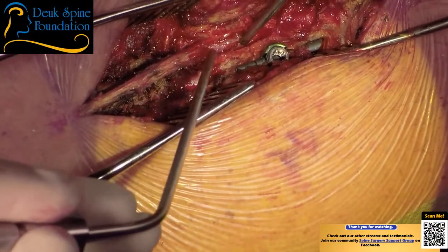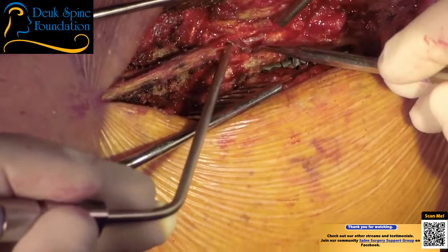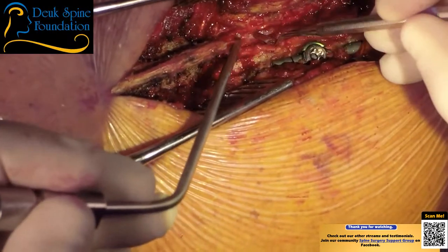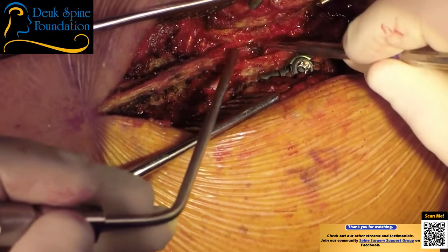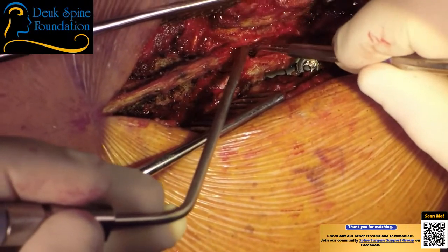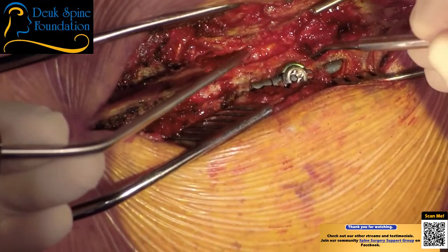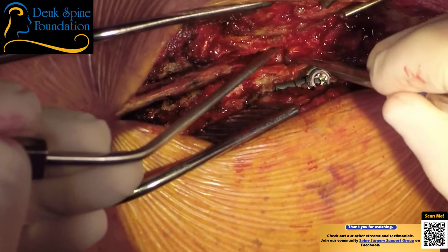Let me have a woody and then an angled curette. We have to be really careful not to push down on the spinal cord. A little bit is okay, a lot of it is not okay. You won't see orthopedic surgeons doing this. This is where they stop. Why? They're not trained to do this kind of work. This is a neurosurgeon's territory. And many won't even do this.